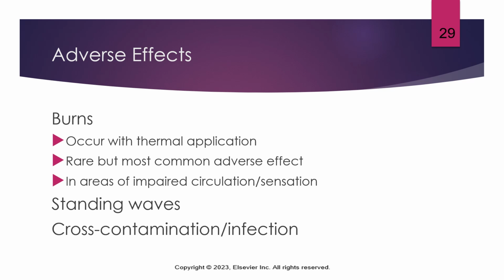Typically burns are rare, but it is the most common adverse effect for ultrasound, and we really want to be cautious in areas where there is impaired circulation or sensation. Just remember that if we have impaired circulation, we may not be able to disperse that heat as effectively as we typically would with normal circulation. Same thing goes for sensation. We want to be cautious there. We don't want to burn our patient and not know about it just because they have poor sensation in that area.